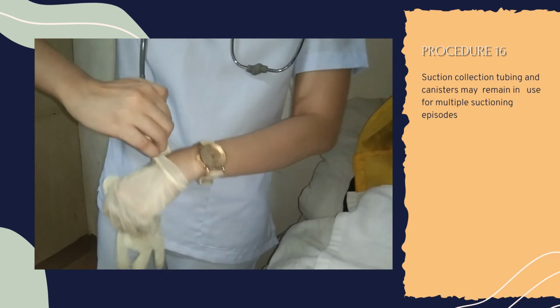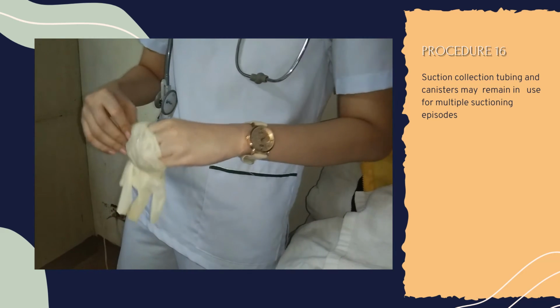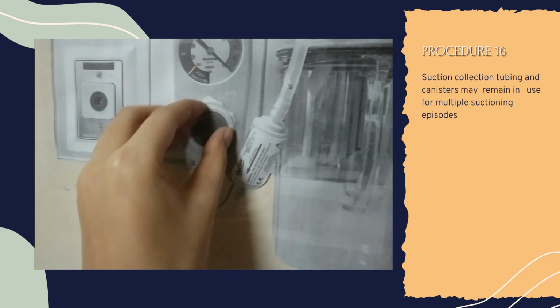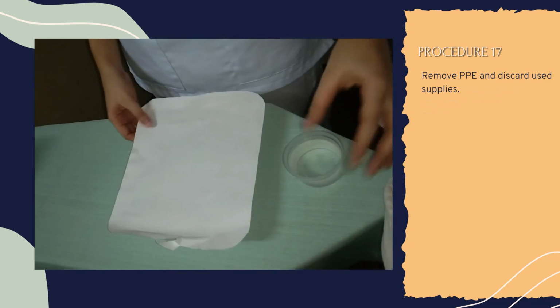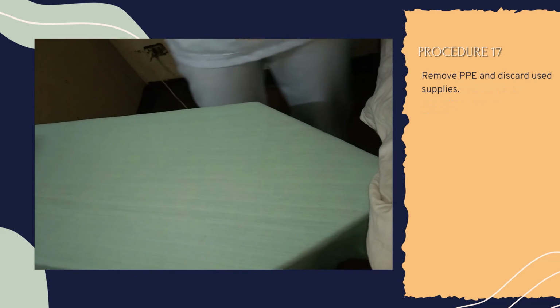Suction collecting tubing and canisters may remain in use for multiple suctioning episodes. Devices that are not in direct contact with the lower airways have not been shown to increase infection risk. Remove PPE and discard used supplies. Proper disposal reduces the risk of transmitting microorganisms.